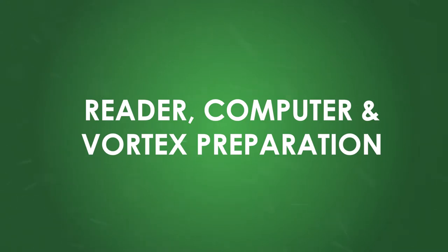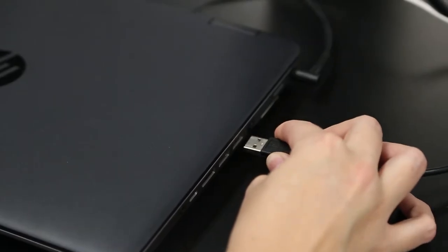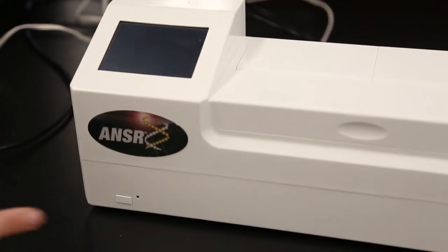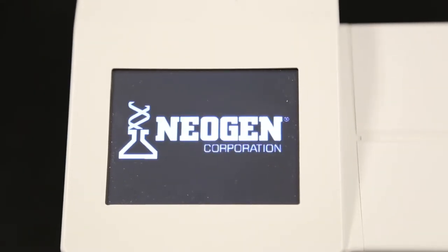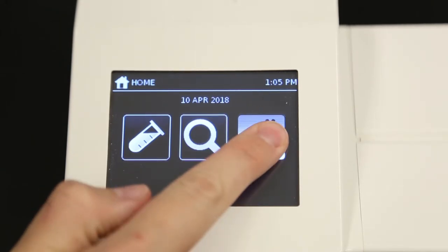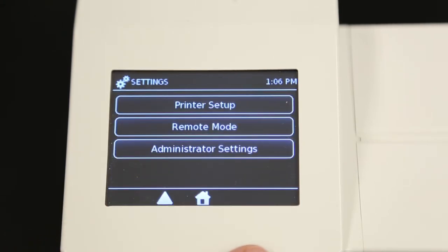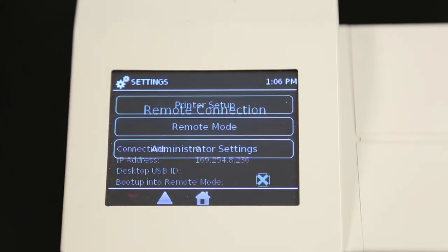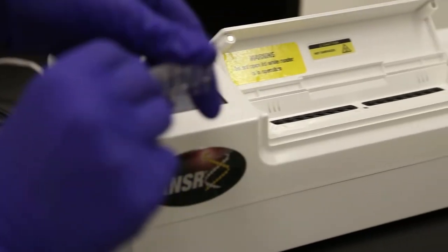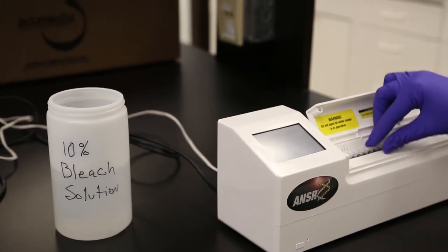Reader, computer, and vortex preparation. Make sure the ANSR reader and provided laptop are plugged in, and the connector is secure. Turn on the ANSR unit by holding the button on the front just for a moment. It takes about a minute to load the software. The first time you use the reader, select the third box on the touch display with the gears, then press the down arrow once. From here, select remote mode. The screen will say remote connection. Note, the reader's lid should remain closed except for placing reaction tubes in or taking them out.